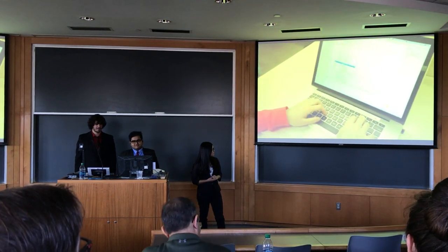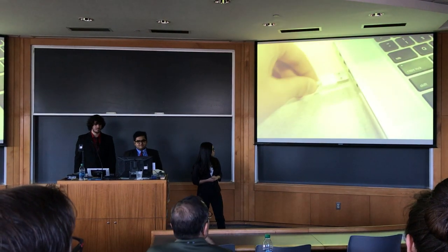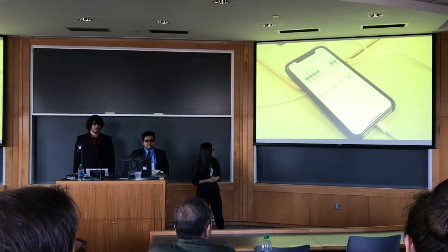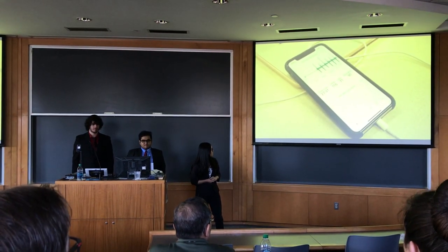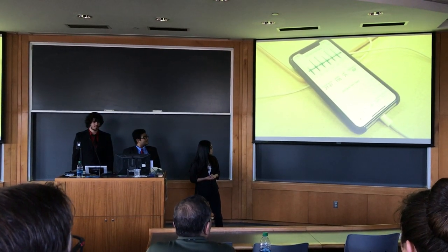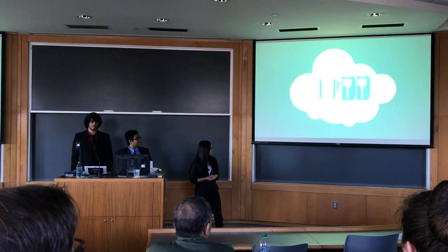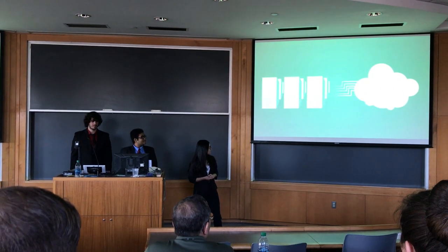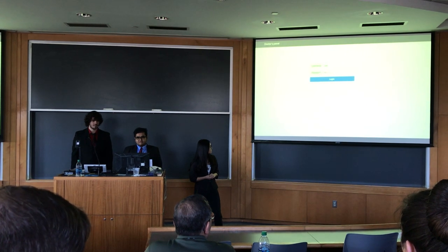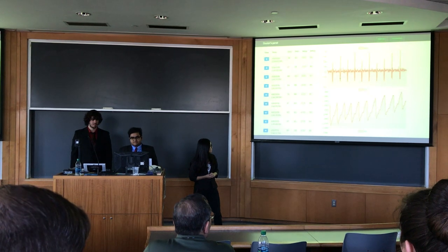For the patient's benefit and easy usage, we have developed an iOS app that displays the processed data in real time. Using various vital extraction algorithms, oxygen level, PPG heart rate, and ECG heart rate are calculated and displayed on the mobile device. The phone acts as a node for the data to be uploaded to the cloud, where it would be accessible to medical professionals and caregivers. With proper authentication, a medical professional can monitor the data from anywhere in the world and take action if necessary.